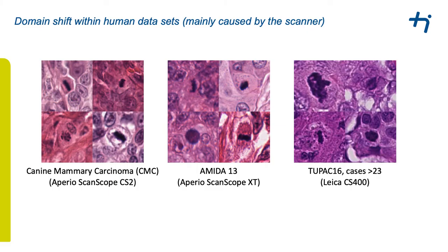We then wanted to answer whether our canine dataset could be used to train models for detecting mitosis in human breast cancer. The answer is: it depends. We fell into an unexpected trap — the major domain shift was caused by the scanner, not the species. Comparing images from the TUPAC16 dataset and its sub-part AMIDAS-13, the only difference was the scanner used. Images from our dataset show a stark similarity to the AMIDAS-13 images, suggesting it would be useful to evaluate on AMIDAS-13 alone.